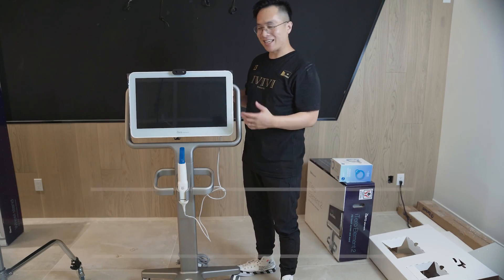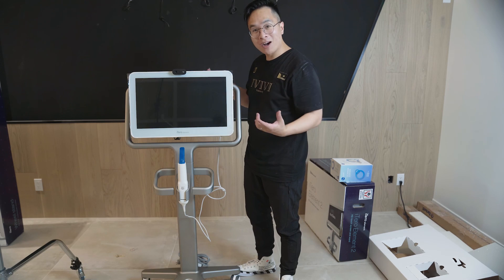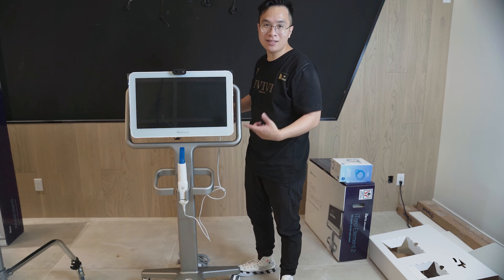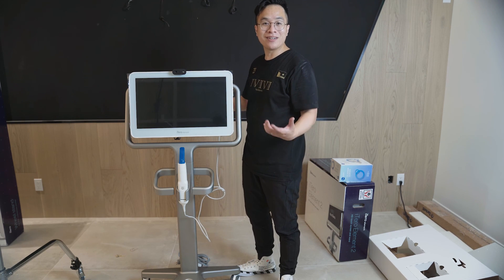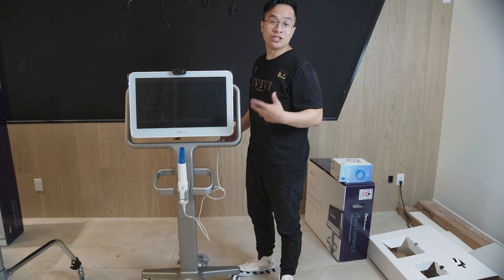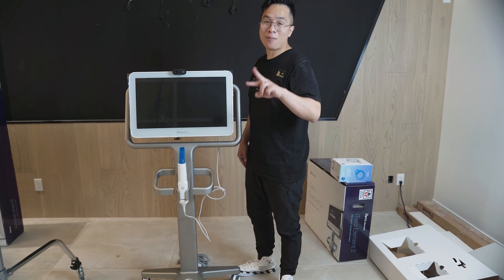There you go guys — I set up a brand new iTero Element 2. We unboxed it, we assembled it, and we're ready to start it up, go through the setup phase, and use this with our patients in order to capture 3D renderings of their smile. Thanks again for watching this unboxing — I hope you enjoyed it, I hope you learned something, and we'll see you at the next one. Peace.